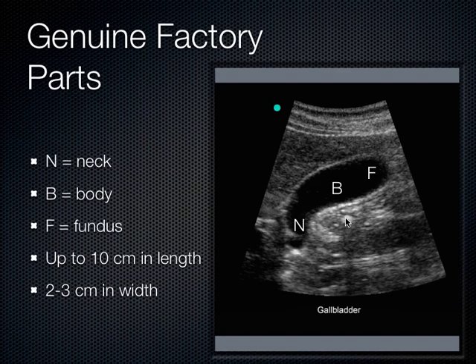So when you're looking directly at the gallbladder, as you fan through any organ and get to the edge, some of that sound starts to get into the organ next door, and it overlays that organ on top of the organ you think you're looking at. That's why some people can easily mistake it: if they get up to the edge of the gallbladder, the air in the duodenum starts to look like it's superimposing over the gallbladder. That's how a mistake can be made, and you say, oh, there's a gallstone, when in reality it was just some air in the duodenum.